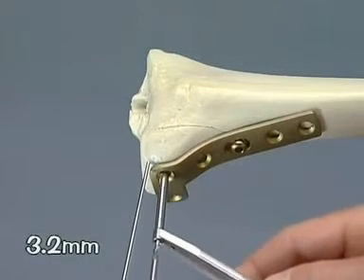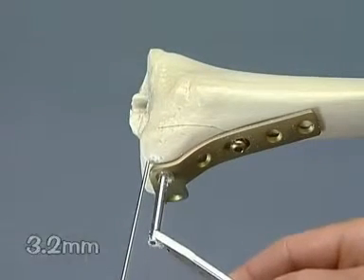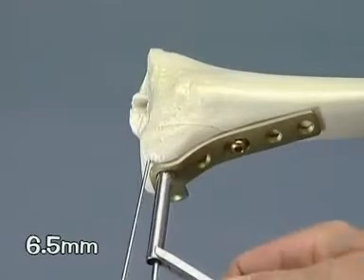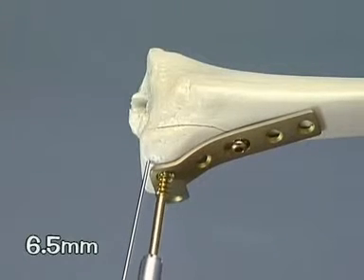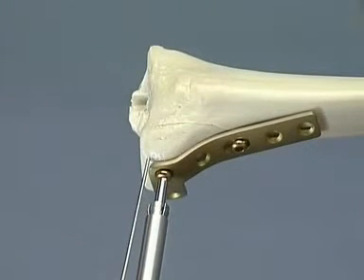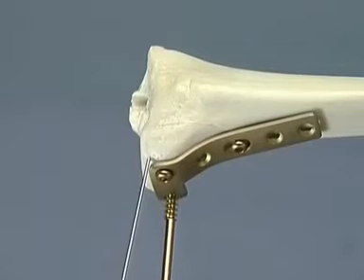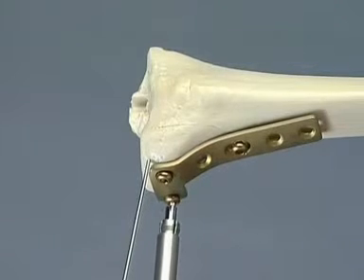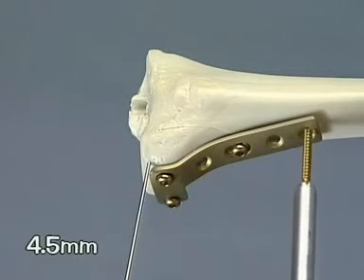Insert a 6.5 mm cancellous screw with short thread through the top plate hole as a lag screw. The screw must not penetrate the opposite cortex. Insert a second cancellous screw with short thread. Fix the plate distally with a 4.5 mm cortex screw.